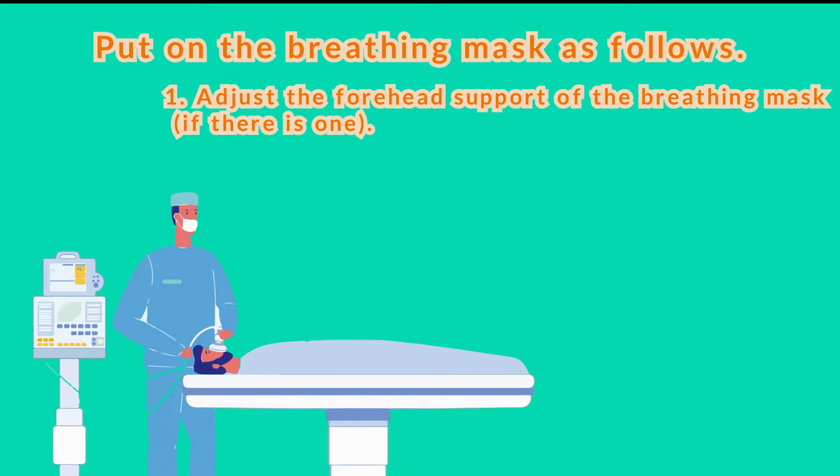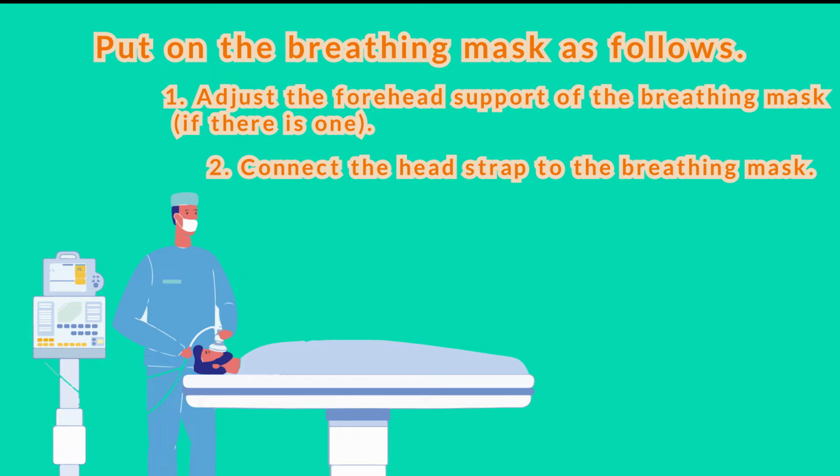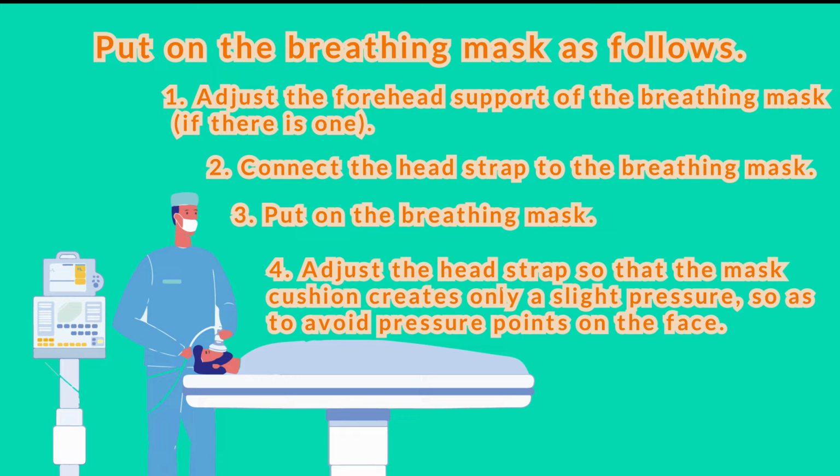Put on the breathing mask as follows. Adjust the forehead support of the breathing mask, if there is one. Connect the head strap to the breathing mask. Put on the breathing mask. Adjust the head strap so that the mask cushion creates only a slight pressure, so as to avoid pressure points on the face.